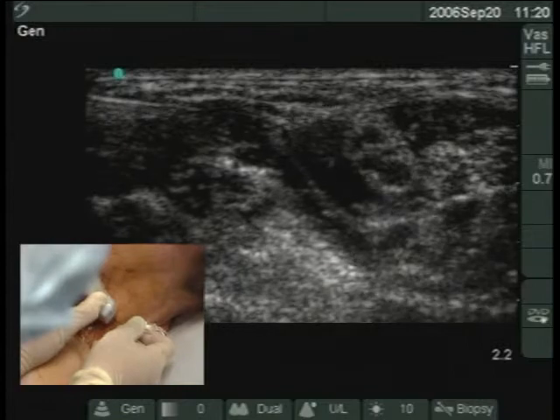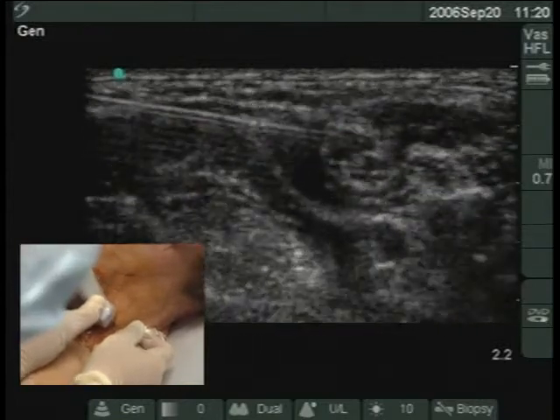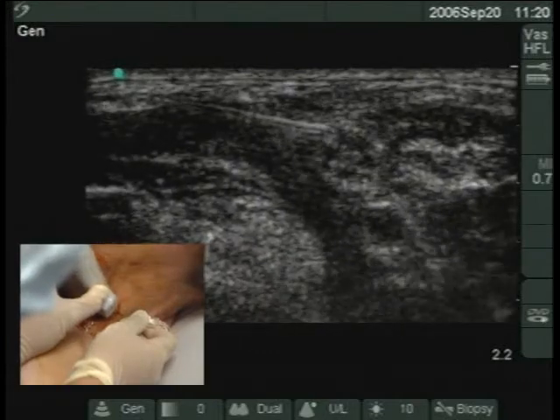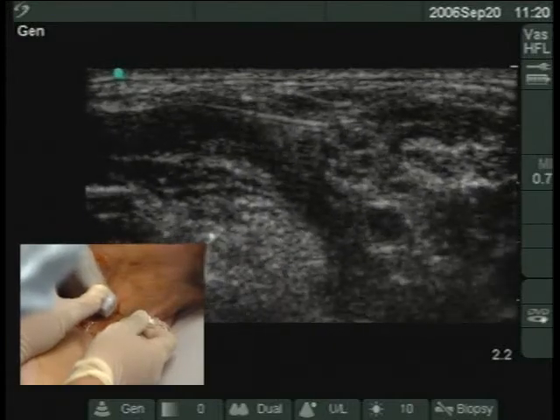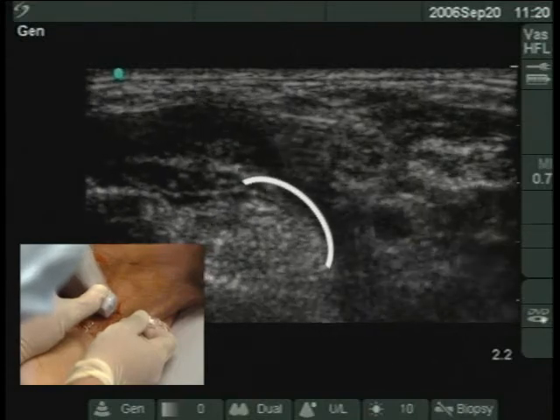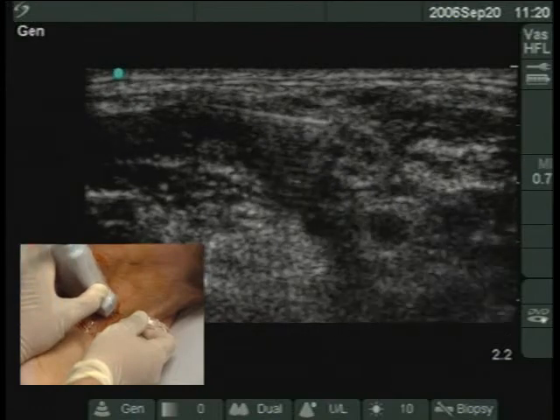The anesthetic will appear as a dark or hypoechoic pool next to the nerve root. An additional 15 to 30 milliliters of local anesthetic are injected in 5-milliliter aliquots. One will see the two scalene muscles separate as the local anesthetic fills the interscalene area.